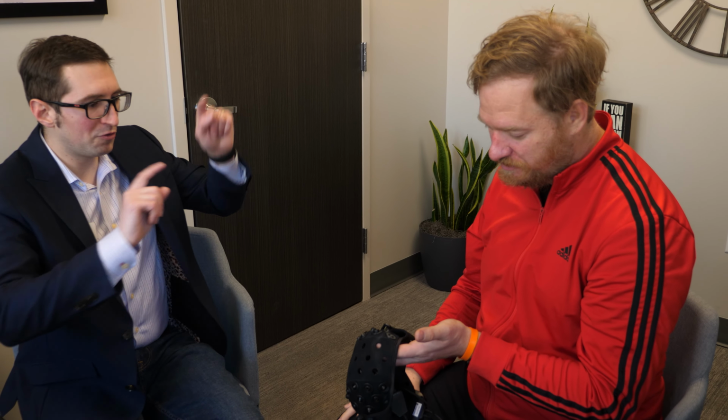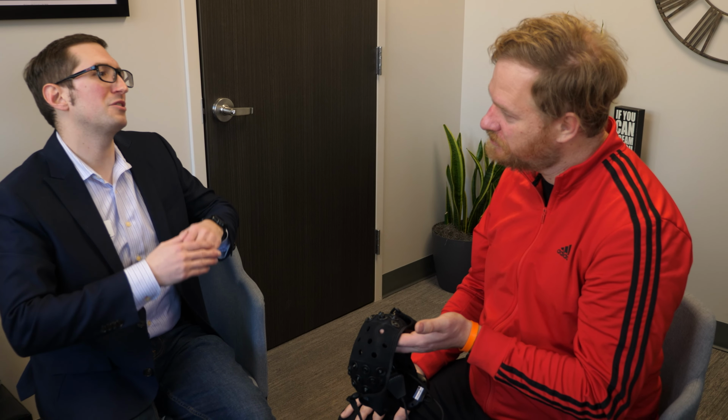Because you're trading off spatial versus temporal. Yeah. So you do have to move through them, and the more and more you put on there, then you're going to sacrifice that temporal resolution for this. But yeah, you're going to get more of the brain. That's really awesome. Yeah, that's very, very cool.